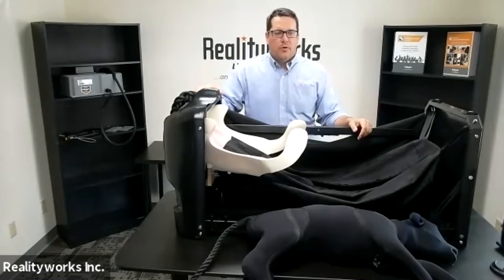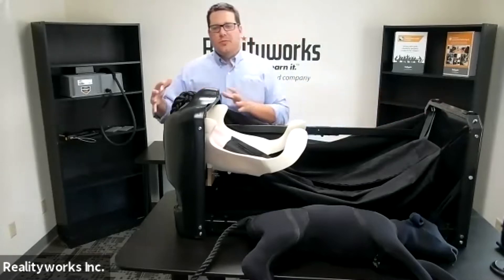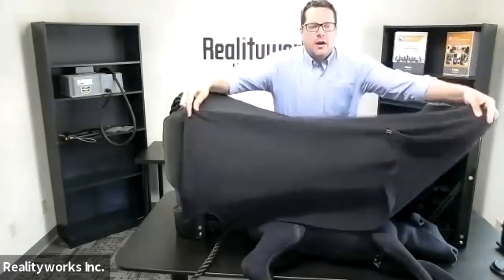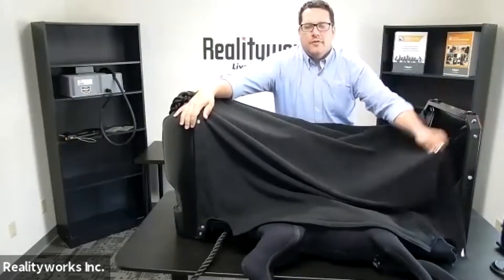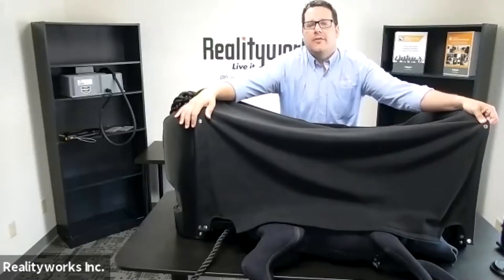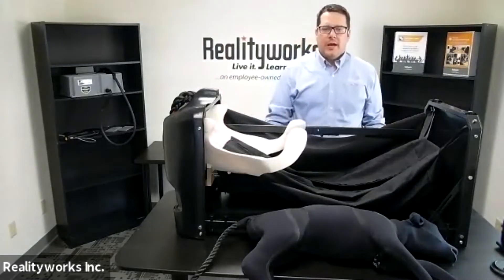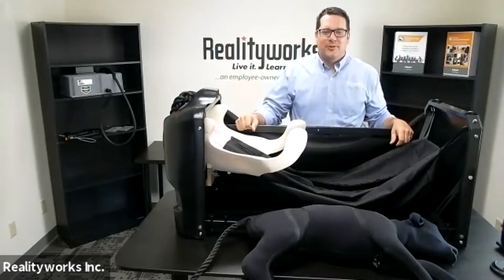Our bovine birthing and ultrasound product is a tabletop model with the rear end — the pelvic girdle of a cow. We have a hide that can go over it and snaps in place, giving a visual where you can't see inside, providing a real-life understanding of what's inside the cow. But as a teaching model, it allows you to open it up and see inside the world of birthing a calf.